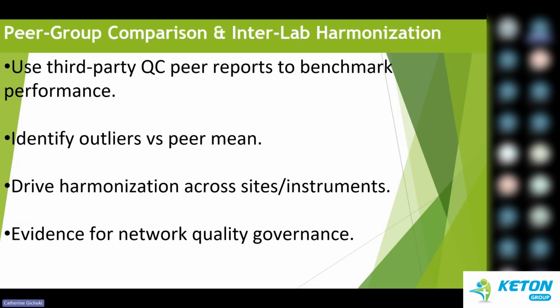Then we spot outliers early. It helps us to spot outliers early. You identify when the lab or specific analyzers is performing far above or below the peer average. You can be able to see these signals. It appears as a signal, and it signals you to identify a possible problem.